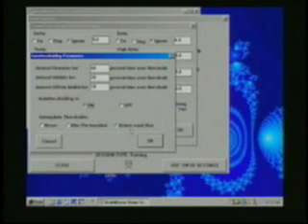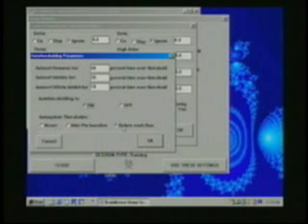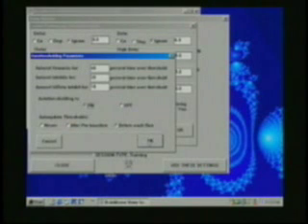And a run would typically be two, three, or maybe five minutes. And we'll leave it to auto update before each run. When you choose auto thresholding before each run, it becomes very automated and hands-free. And we'll be demonstrating that type of operation.